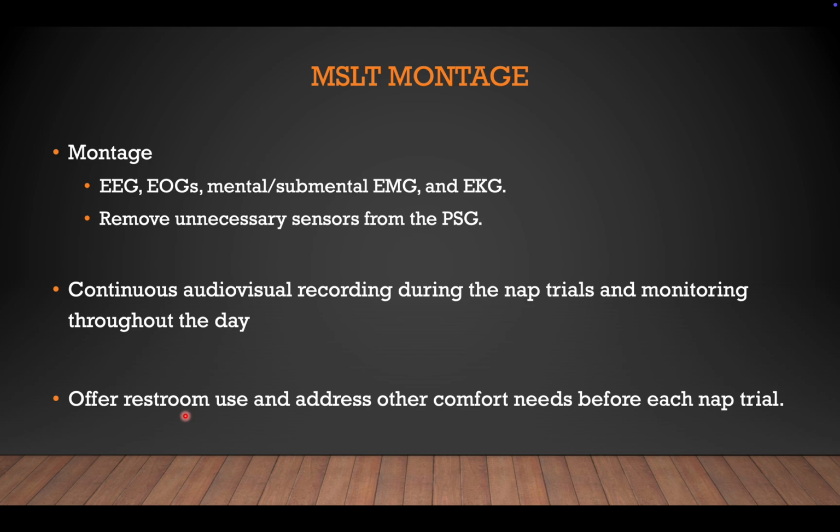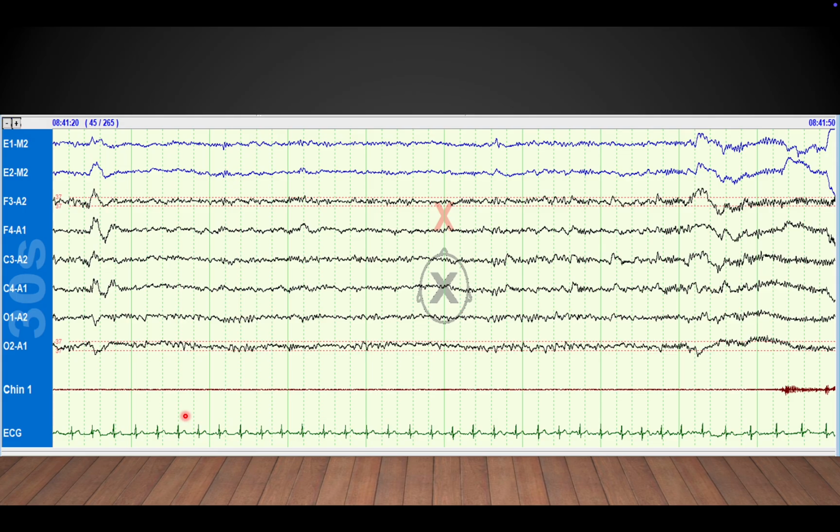Continuous audio-visual recording during the nap trials and monitoring throughout the day is required. And offer restroom use and address other comfort needs before each nap trial, so that the patient is prepared ahead of the nap trial and there will not be a delay, because the MSLT is a time-bound procedure.